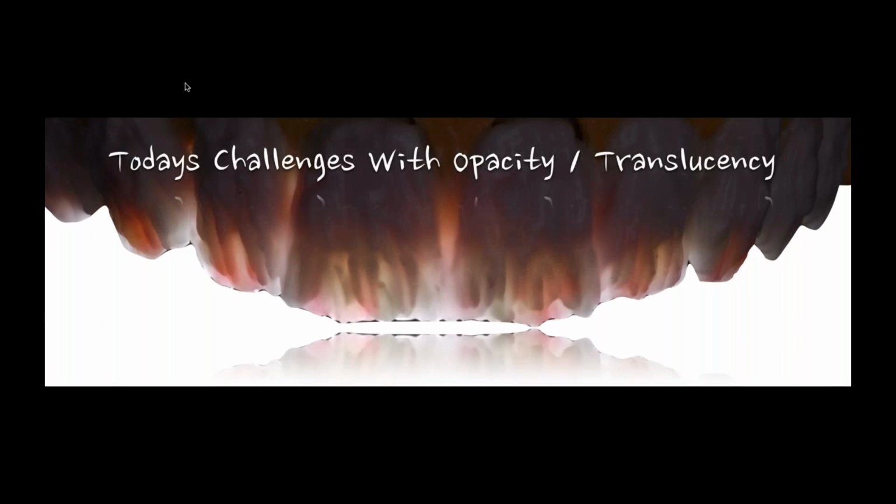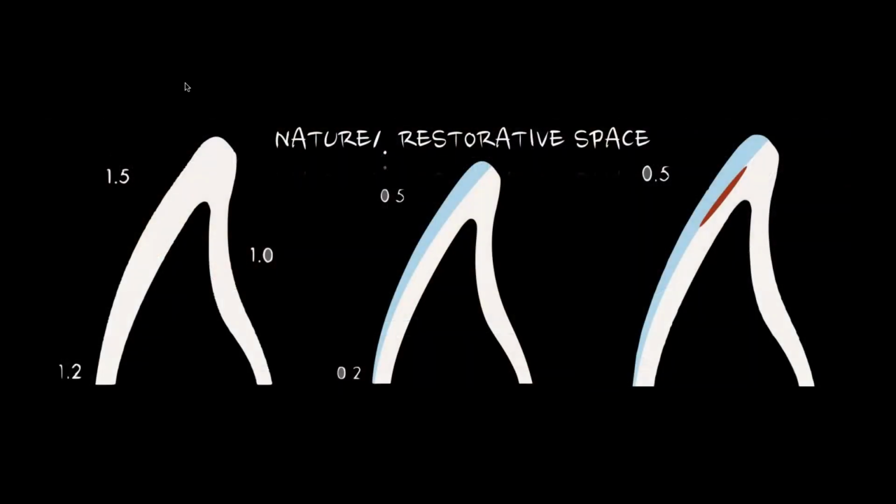I say today because I think the challenges have changed over the years. Years ago, aesthetic cases were mostly PFM or veneer. Today we have everything from zirconia, several different types, to lithium disilicate, different types, and several other materials, with new things coming down the pike all the time. It's kind of interesting that I find what we lack the most is our basic understanding.